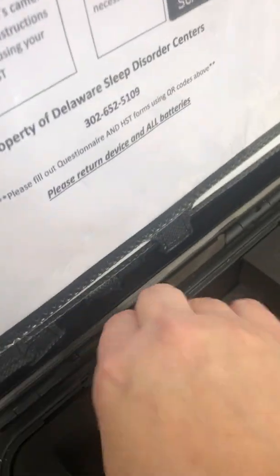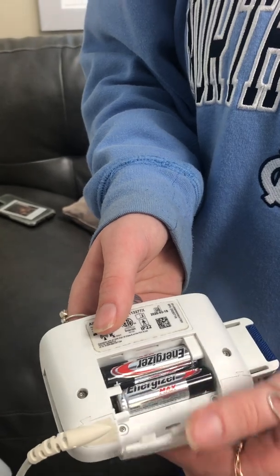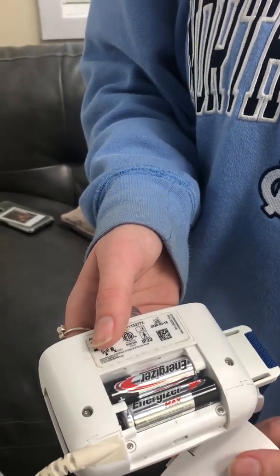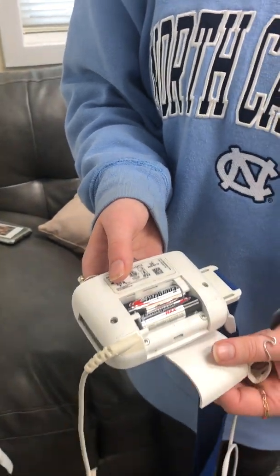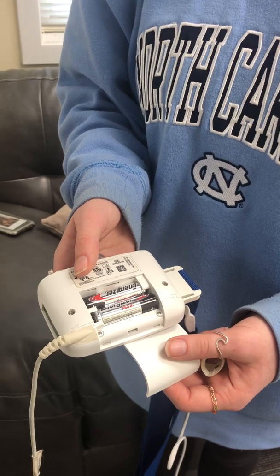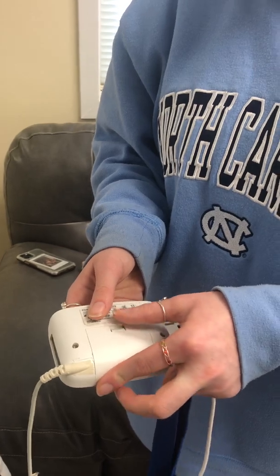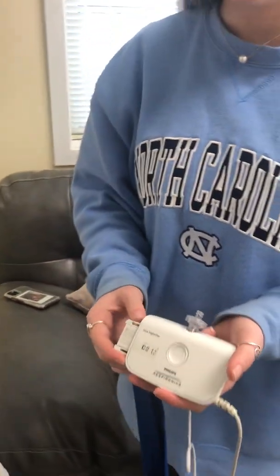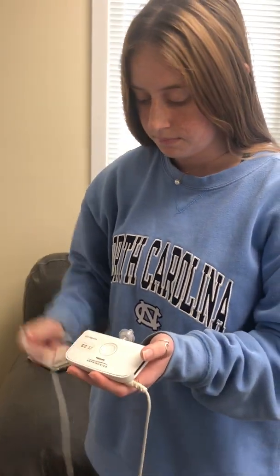If for any reason you need to replace the batteries, please take the spare batteries, open the back of the device, pop the batteries out, and replace them. The batteries should last for two nights and should only be replaced if you are unable to get the device to turn on. You want to use this device for approximately six hours. After both nights, simply return all items back to the case and return to our location.